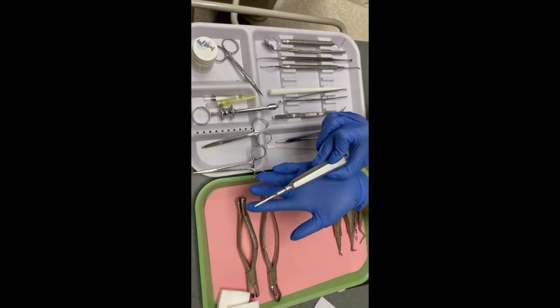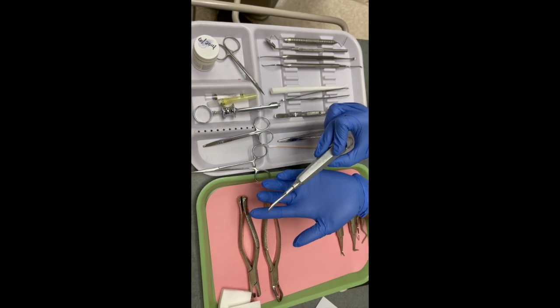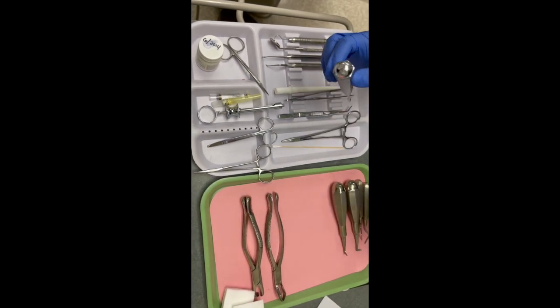Next you have your luxating elevator to cut the periodontal ligaments before extraction.